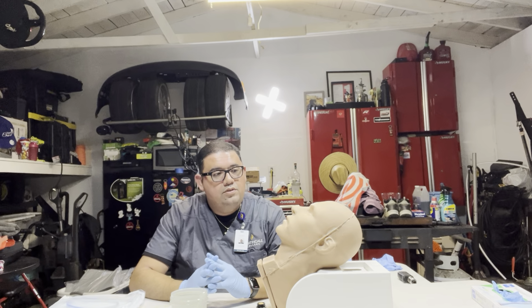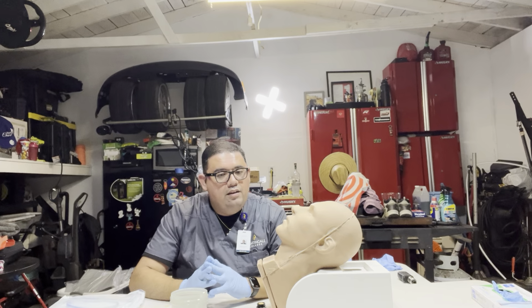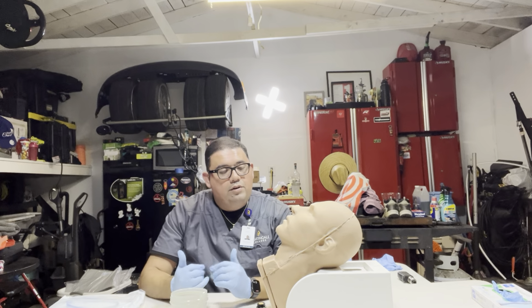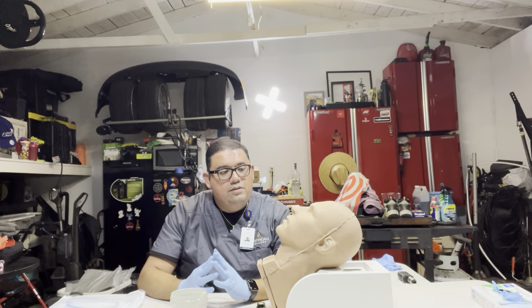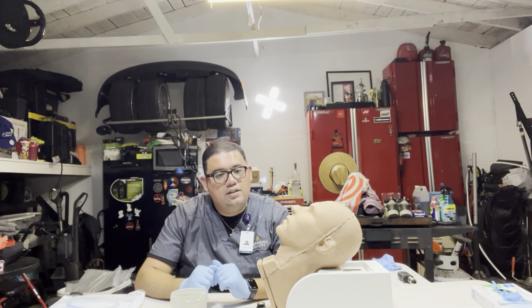Hi, Mr. James. I will be your nurse today. My name is Michael. Can you please tell me your name and date of birth? Thank you. Verify the patient by two identifiers. I will explain the procedure I will be doing for you today. I will be inserting a nasal gastric tube into your nostril that will reach into your stomach to help give you some nutrition.